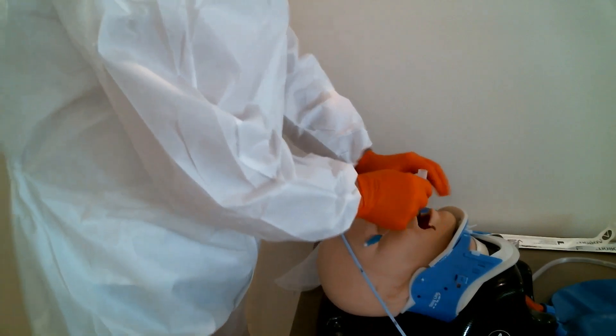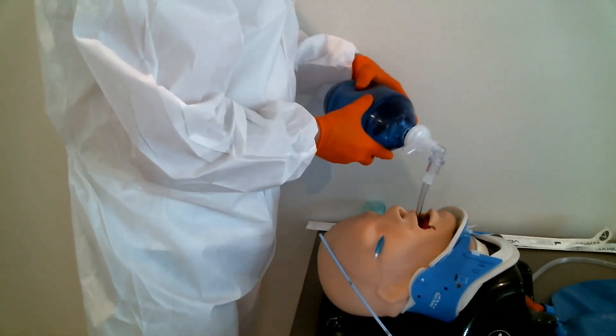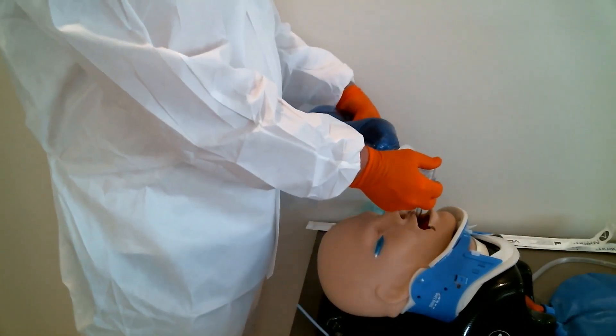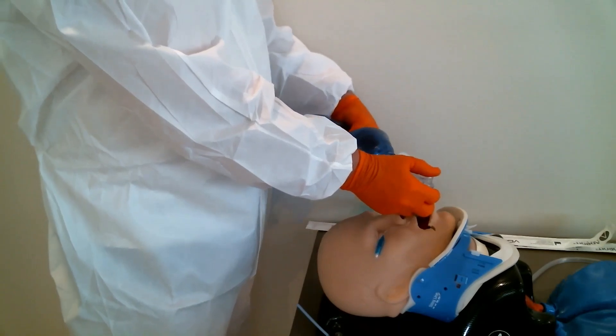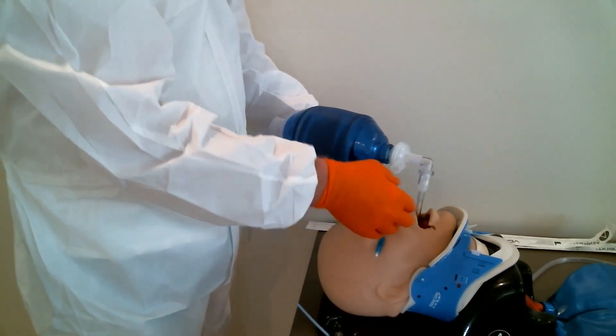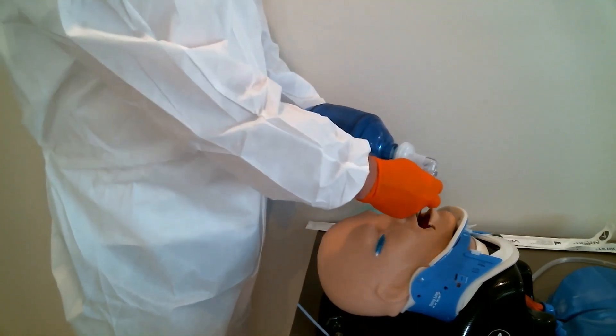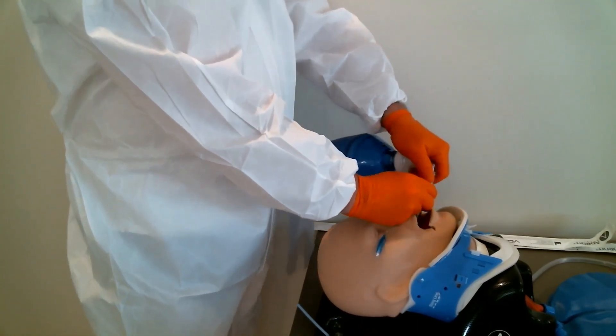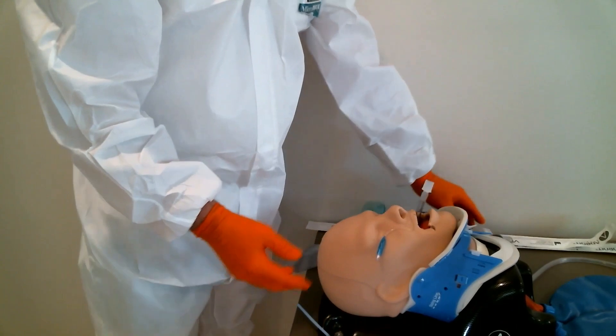I'm going to remove the bougie and now ventilate the patient. So I've tried in this droplet-producing procedure to limit my exposure distance. The time was minimized because we quickly intubated, and these are fully disposable devices.